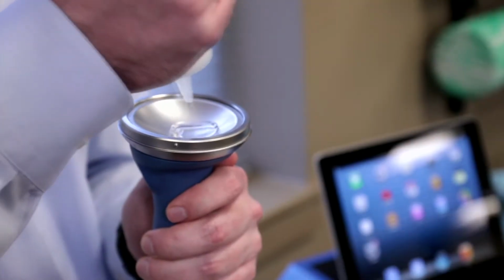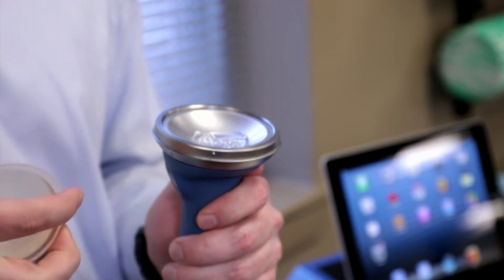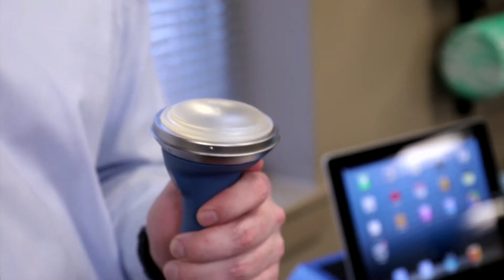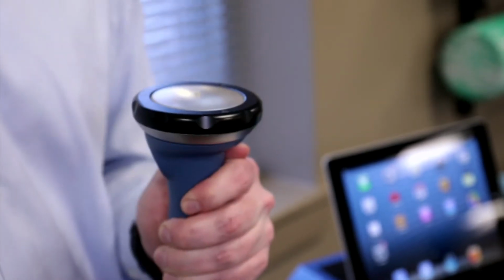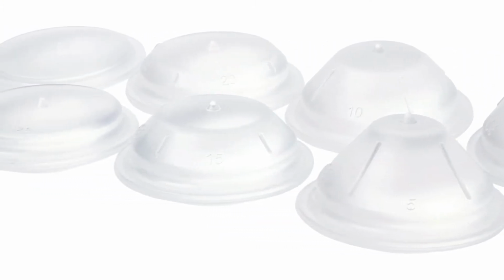Apply a sufficient amount of the recommended LithoClear gel to the center of the contact surface of the therapy source. Place the gel pad onto the therapy source. Install the twist lock ring and turn it clockwise to lock. Select the gel pad in accordance to the required penetration depth.